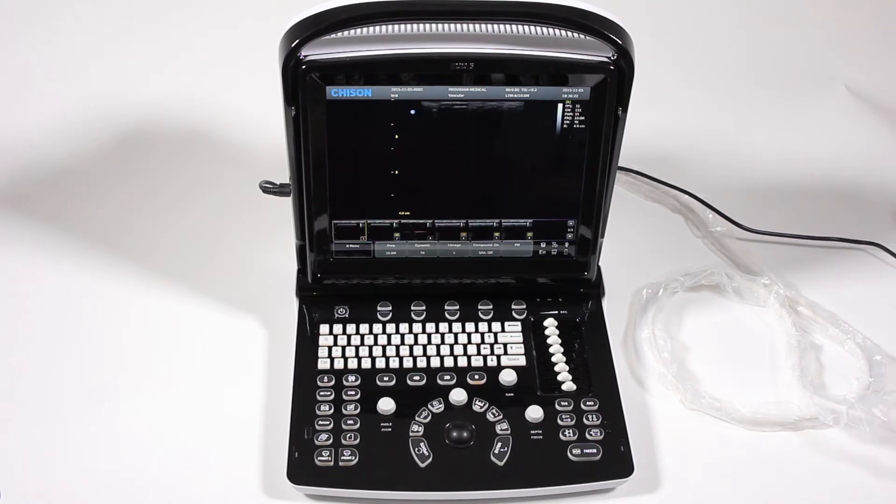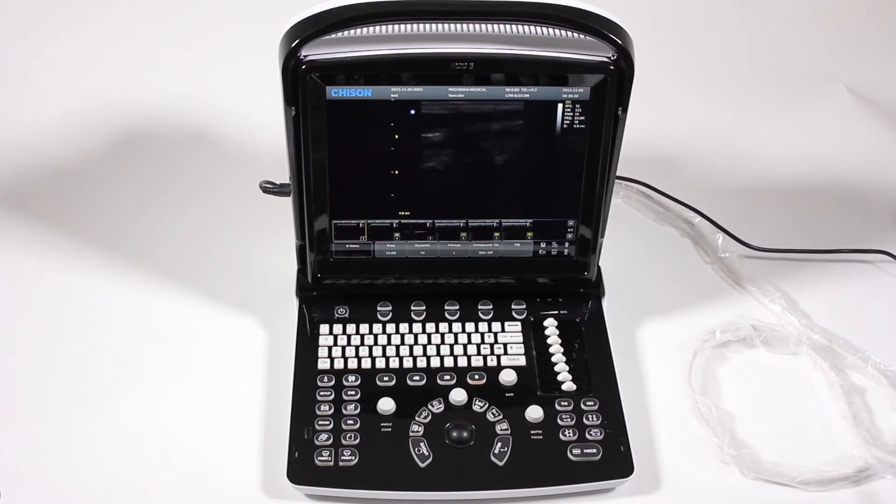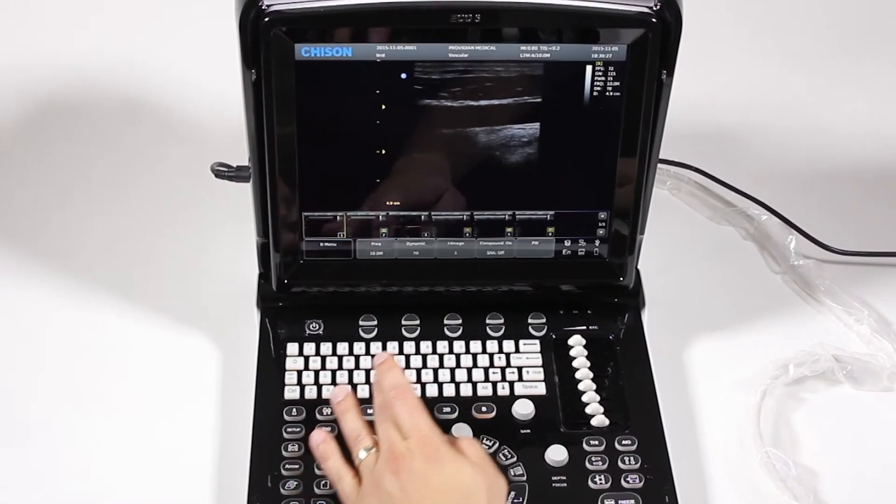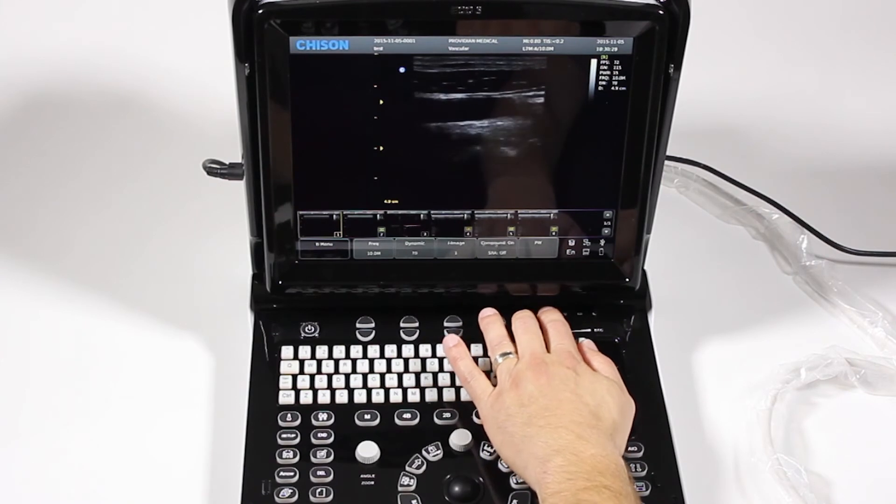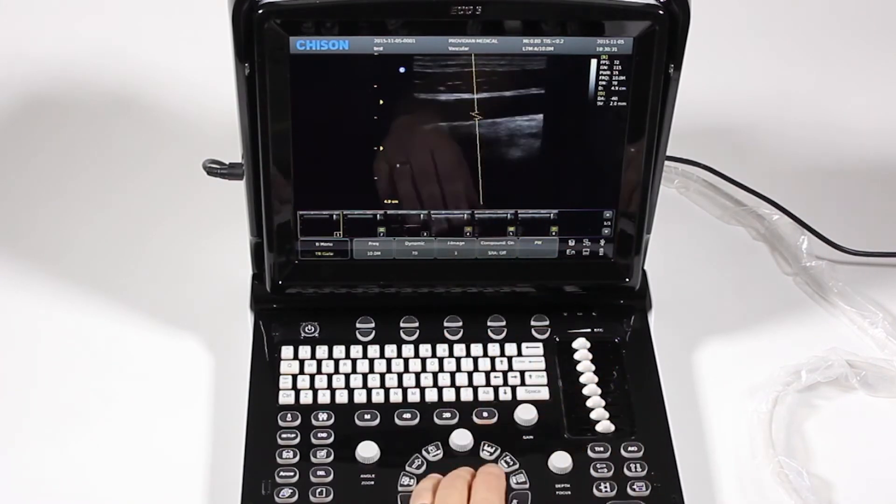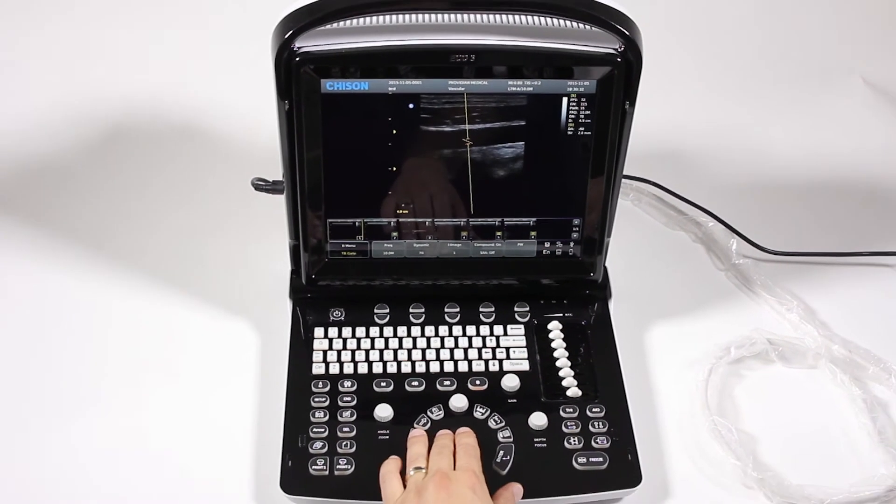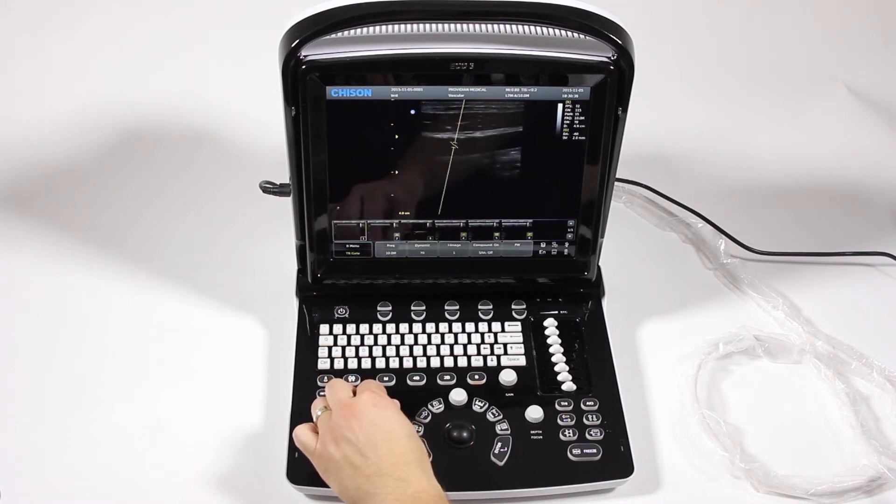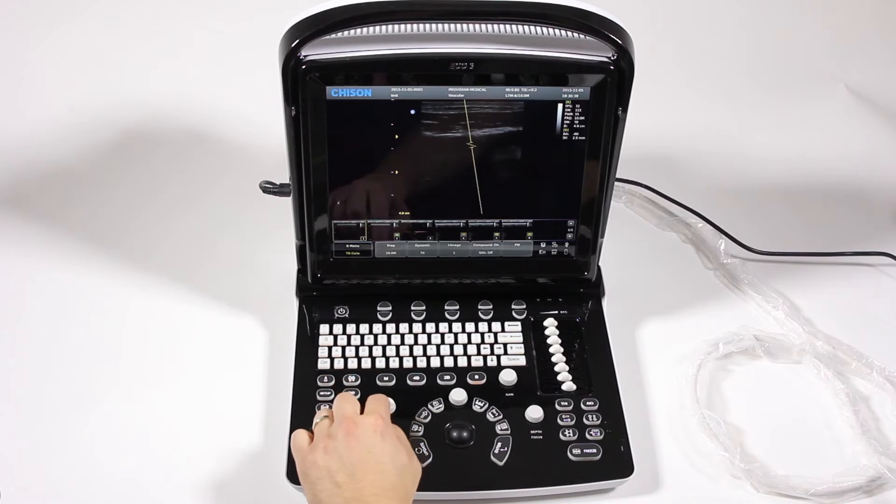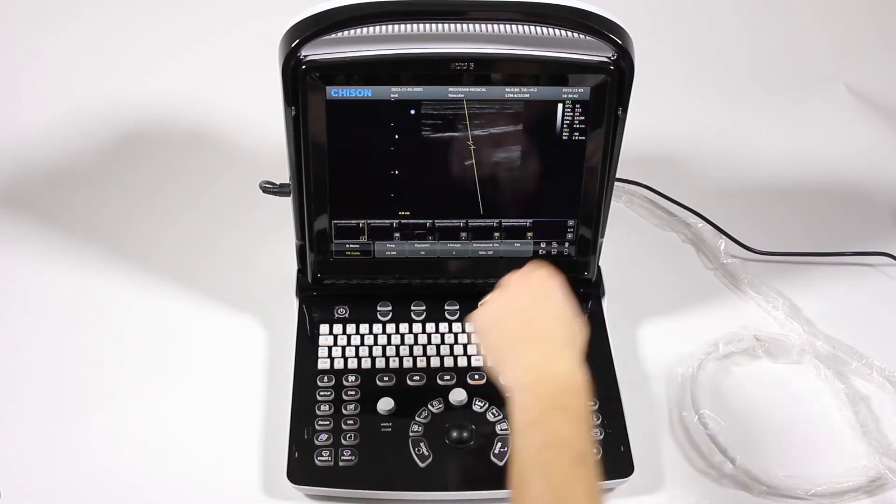So if I get my image, let me just throw something up on the screen there. I will choose this PW up here. It's going to give me my Doppler line there. I can use angle to adjust that, and I can press angle to do my angle correction.